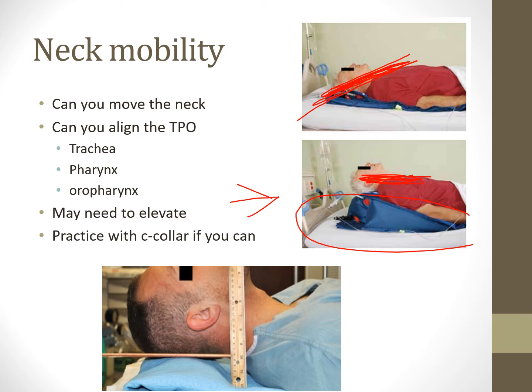So elevating the patient, if it's safe to do so, to line up their ear with the sternum is evidence-based. Do it. You will not regret it. Neither will the people you work with. It will be a lifesaver. Literally, it will be a lifesaver. You will be able to get so many more intubations lining up the ear with the sternum than you ever will with it out of line.